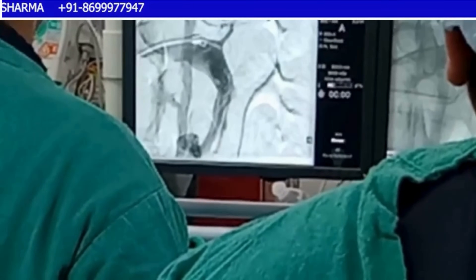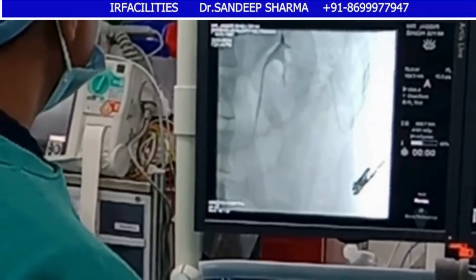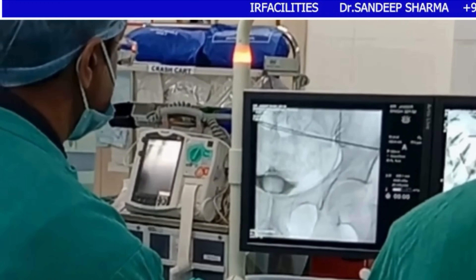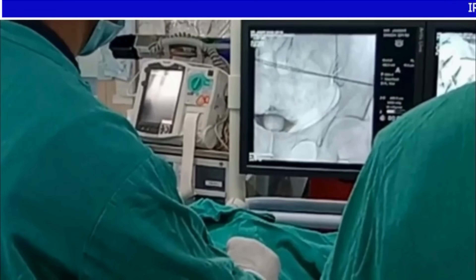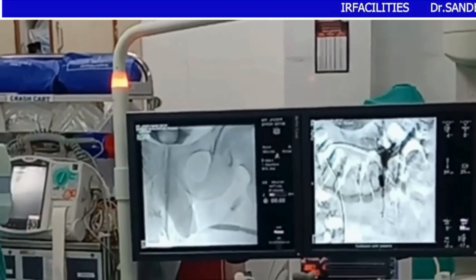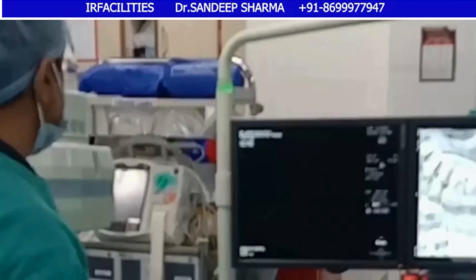Once the right side is completed I'm back into the left side to explore again. This time I have taken a longer picard catheter which gives me an acute curve to explore previously unexplored areas - the more distal ones. With this I can demonstrate the gastro-renal or leno-renal communication upper variation. Turning down, I have now found the ostium of the testicular vein right next to the azygous - immediately distal to the azygous, almost sharing a common origin with it. I find this in most cases when there is a large or small azygous in the left renal vein - the testicular vein ostium is almost immediately distal, almost sharing the ostium. I now demonstrate a high-grade varicocele - it is so big with so much reflux.